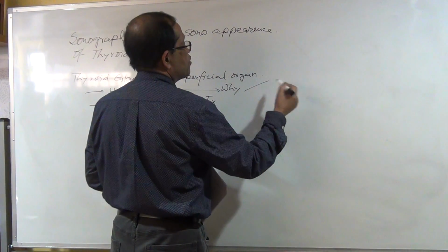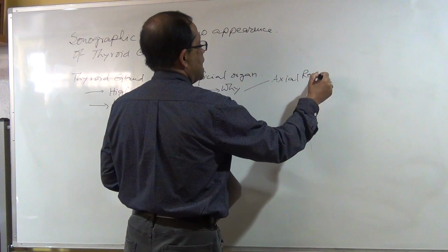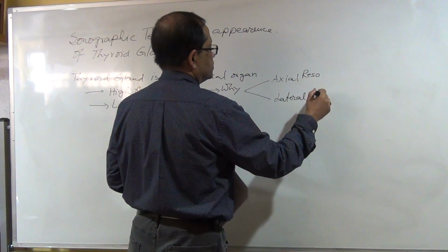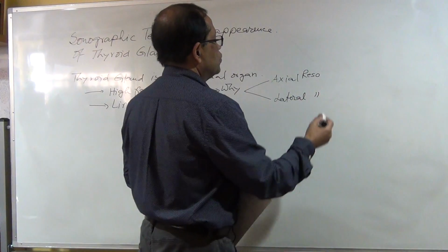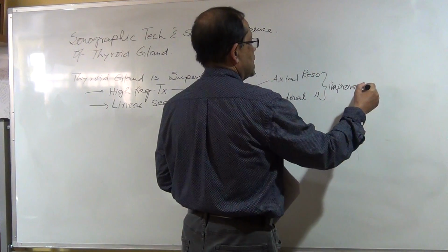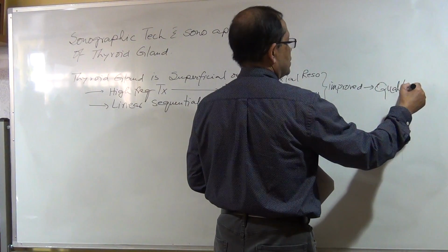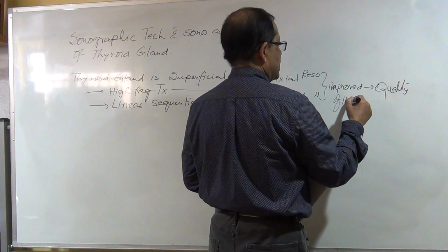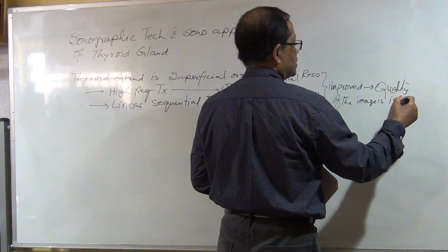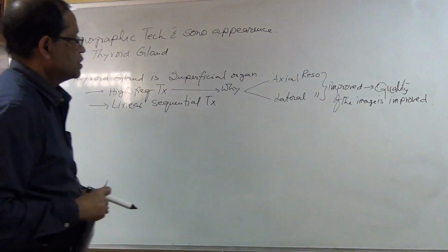transducer will improve the axial resolution and also the lateral resolution. Both resolutions will be improved. And as a result, the quality of the picture, the quality of the image, is improved. Okay? So this is important.